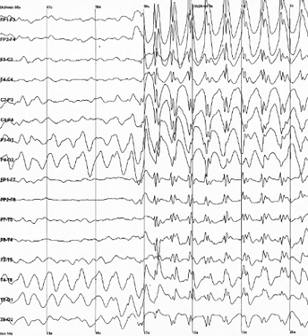These can occur as interictal activity, between seizures, and represent an area of cortical irritability that may be predisposed to producing epileptic seizures. Interictal discharges are not wholly reliable for determining whether a patient has epilepsy nor where his/her seizure might originate. See focal epilepsy. Generalized epileptiform discharges often have an anterior maximum, but these are seen synchronously throughout the entire brain. They are strongly suggestive of a generalized epilepsy.